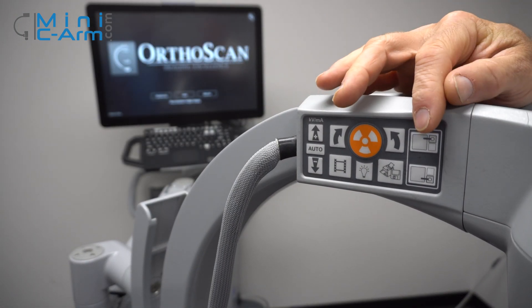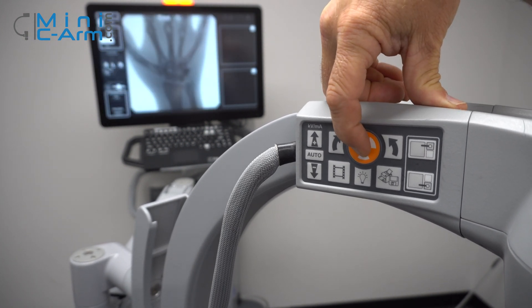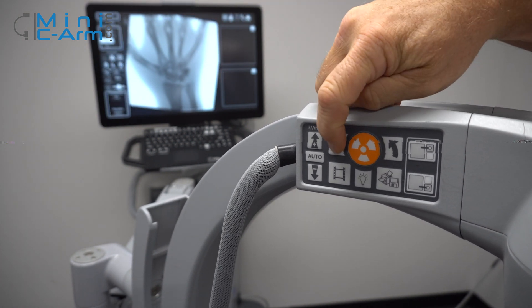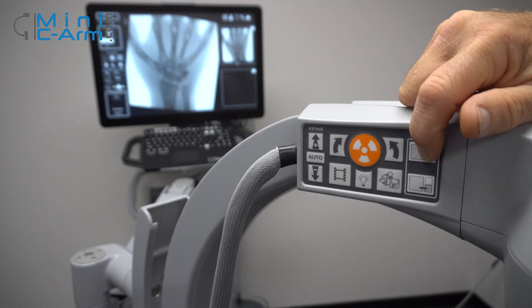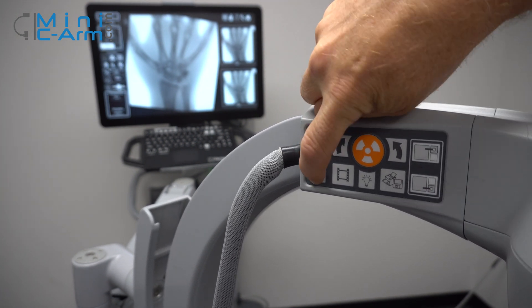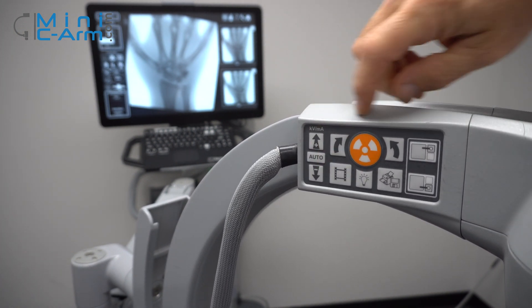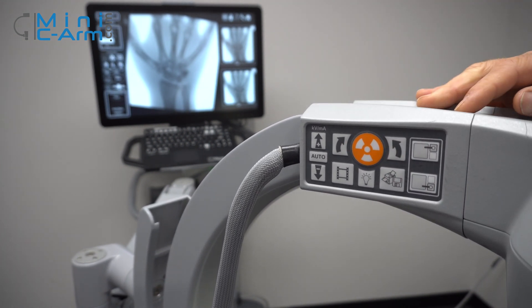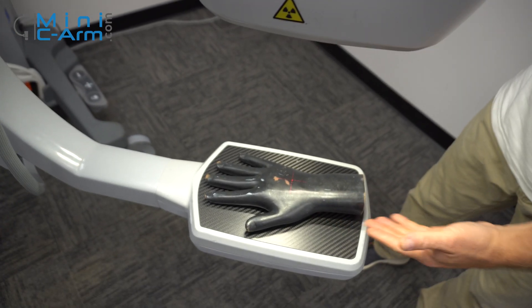Here are the two pad controls for the OrthoScan FD Pulse. The orange button is for x-ray — hold in for two or three seconds to get a nice image. You have your rotation buttons, clockwise and counter-clockwise. You can tag either one of the tagged areas. You can change your technique up or down and put it back on auto. Here's your cine loop and save and print. And here is your sterile field lighting, along with your laser.